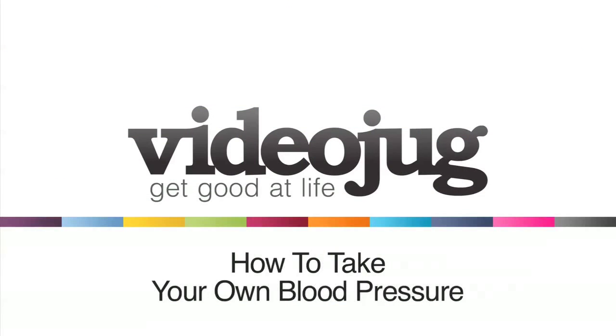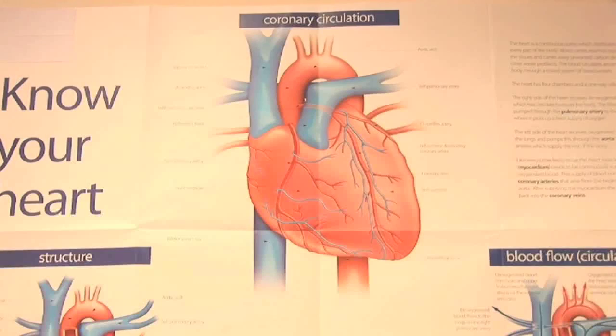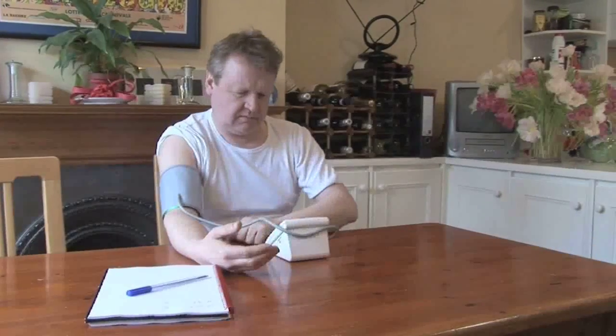How to take your own blood pressure. Hello and welcome to Videojug. We've come to the Blood Pressure Association in London. Savita Sharma is going to demonstrate how to take your own blood pressure. Self-checking is not a substitute for having your blood pressure measured by a medical professional, but if you do suffer from high blood pressure it can be a useful way of helping your doctor to monitor your blood pressure away from the surgery as you go about your everyday life.